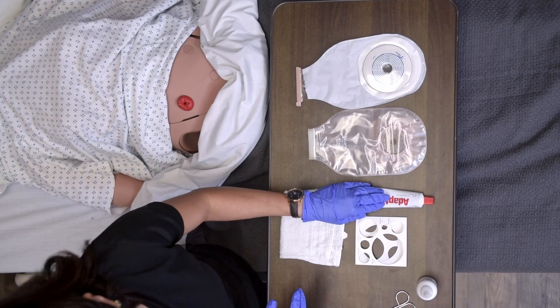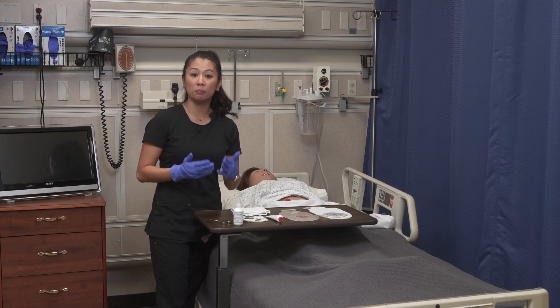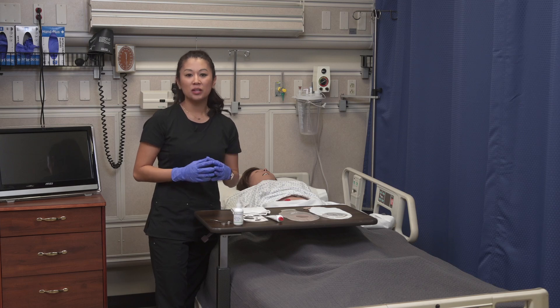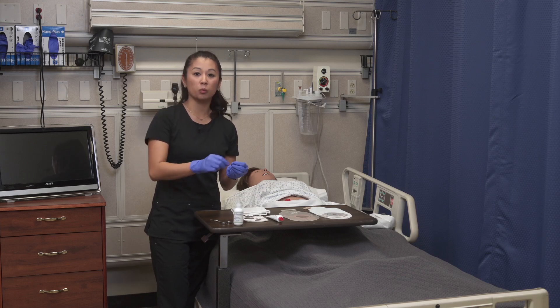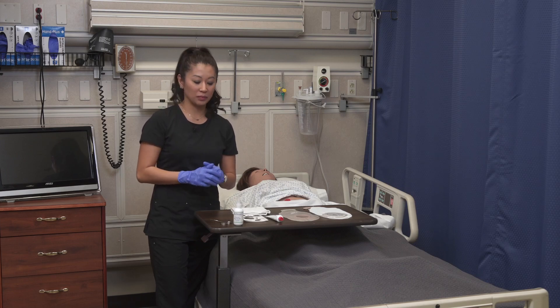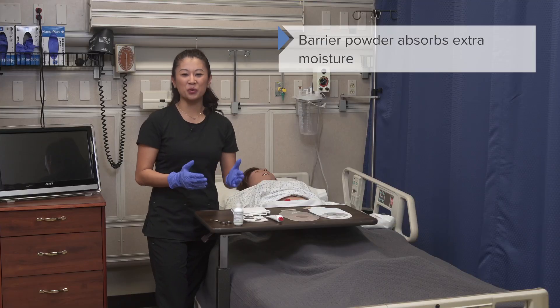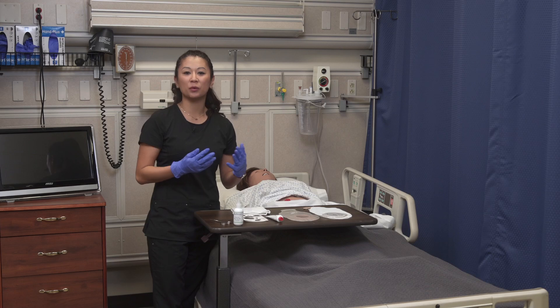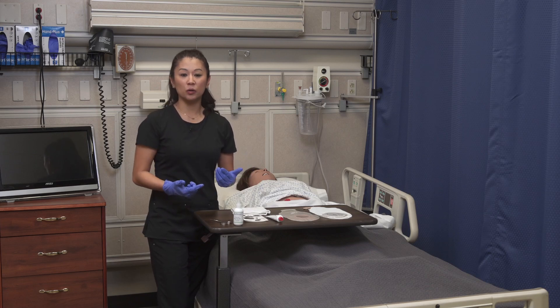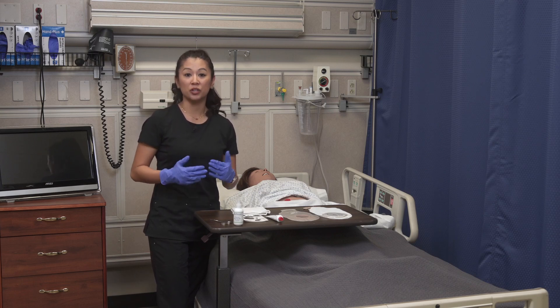Now let's take a look at the stoma paste. You may need this if the patient's skin around the stoma is irregular or bumpy and we need to help create a seal. The stoma paste is applied around the skin of the stoma to help fill in the gap between the stoma and the wafer when applied to the patient. We also have barrier powder, which is helpful because if you have irritated or excoriated skin, it's really nice to absorb some excess moisture.